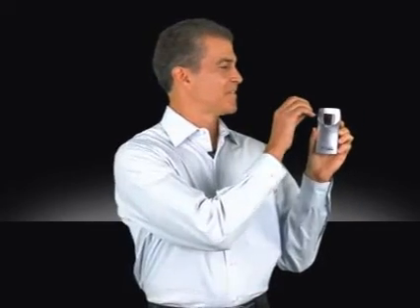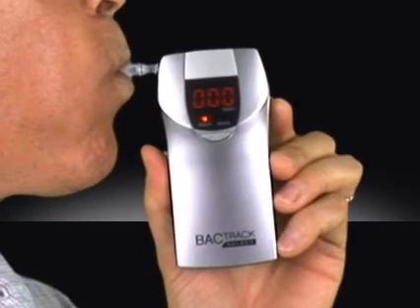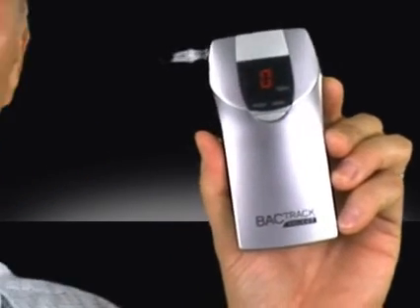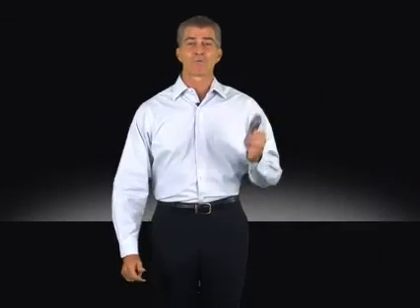To use, simply attach a mouthpiece. Exhale into it for five seconds, and read the display. Its proprietary flow check feature ensures a deep lung air sample for accurate readings.